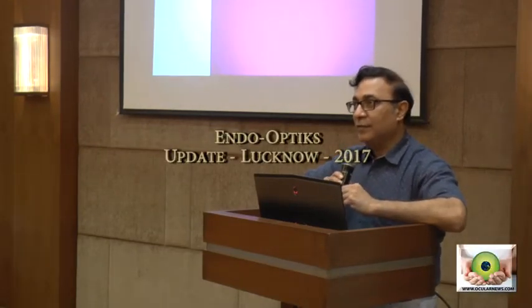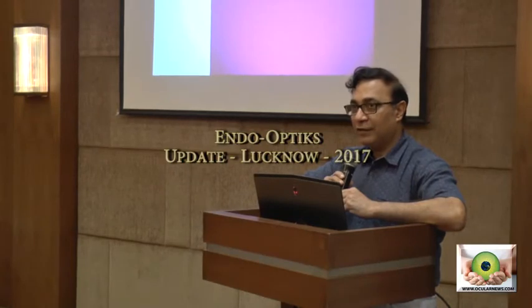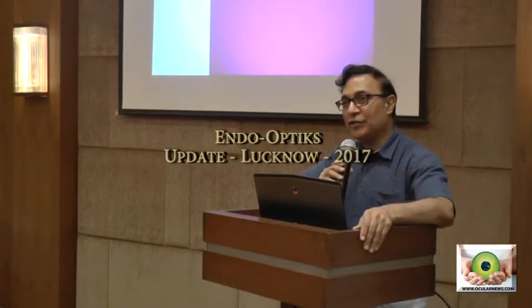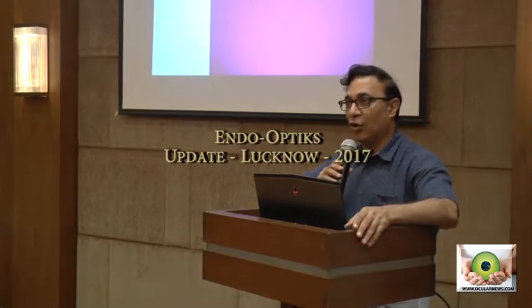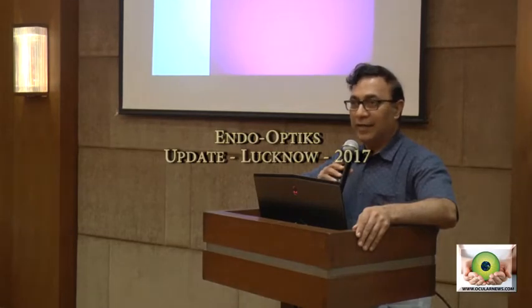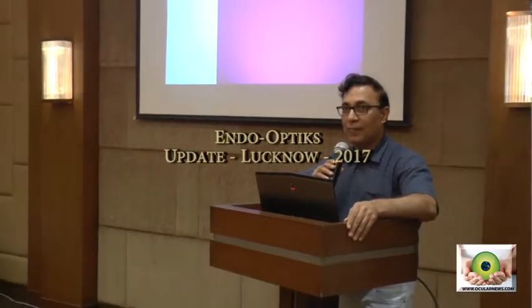We'll be discussing a little different aspect of endoscopic surgery, which is different from the conventional surgery we were doing in retina and glaucoma. This is regarding an endoscope, which is really a thin scope having laser, light and camera all in one.